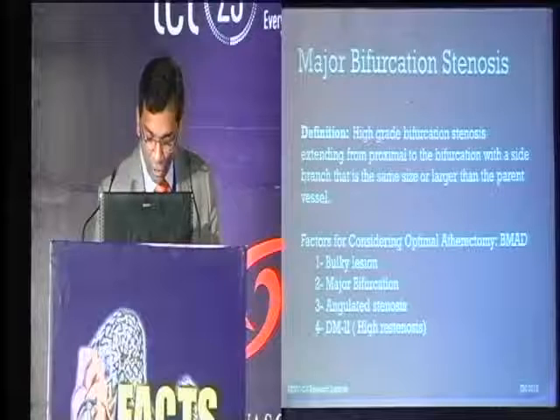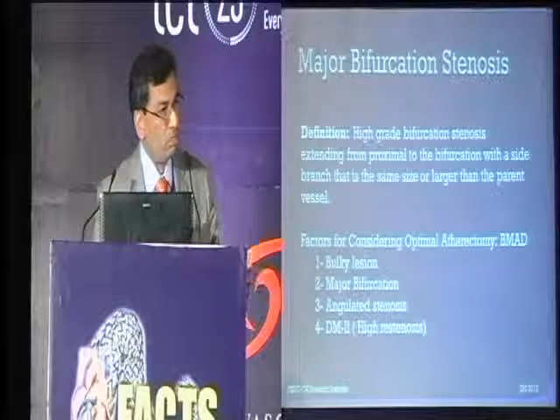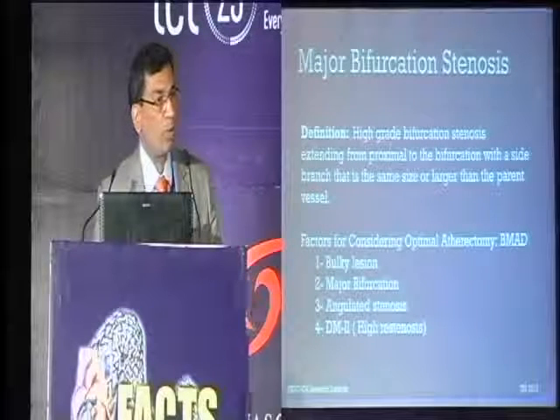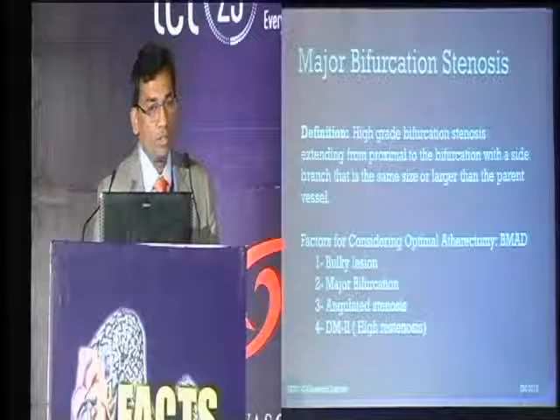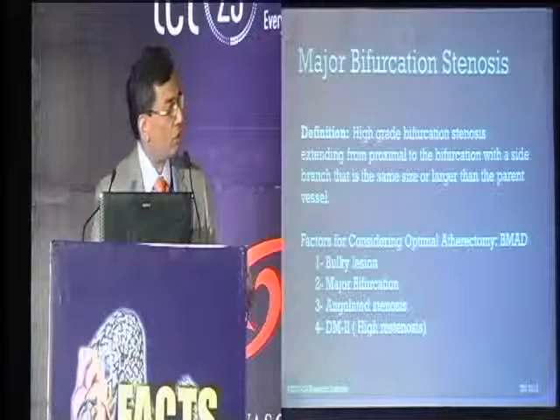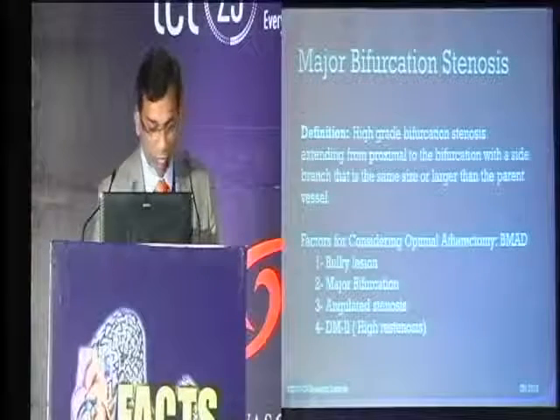These are the cases that I tend to try and use Silver Hawk, which is the directional atherectomy catheter. I'm very comfortable using it. I've done a lot of work on peripheral vascular disease using atherectomy. So I use Silver Hawk atherectomy for coronary indication, which is the topic to discuss today.